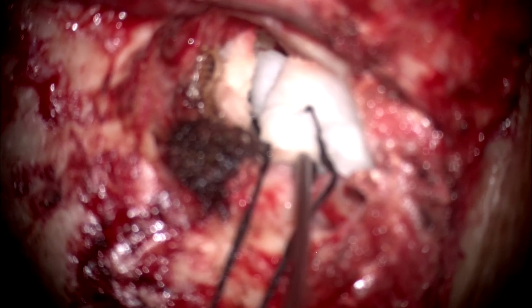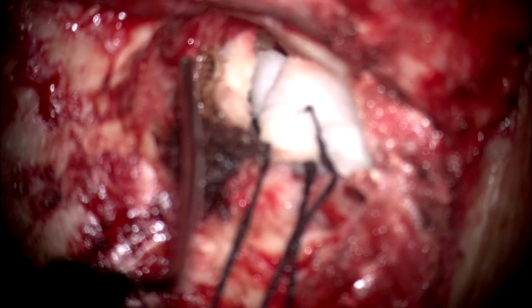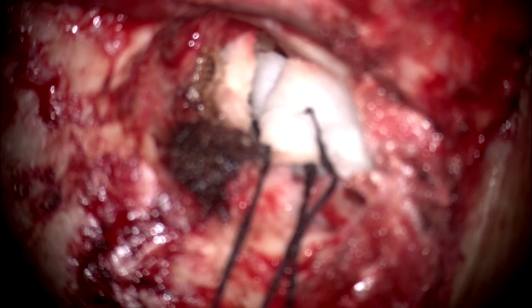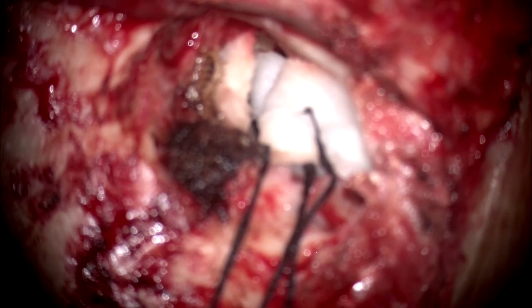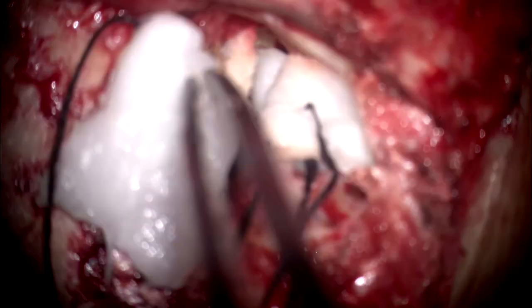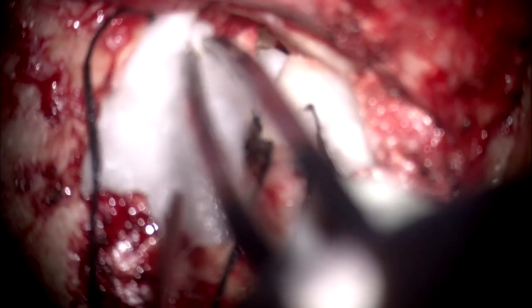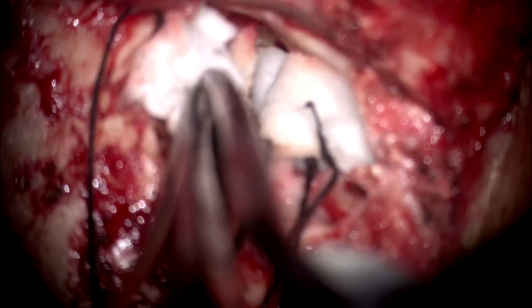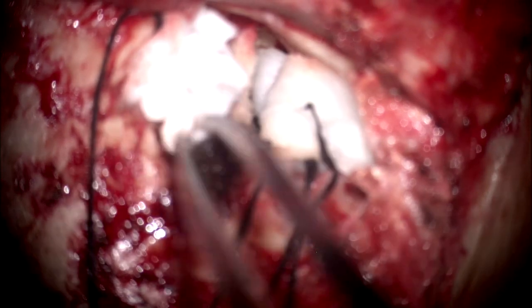That's what we have been doing; this additional 1 hour is to control the hemostasis. Hemostasis is most important. A hematoma can happen if the bleeding goes on. Suppose a hematoma develops in the post-operative period, then you have to go back, evacuate it and see the hemostasis again.